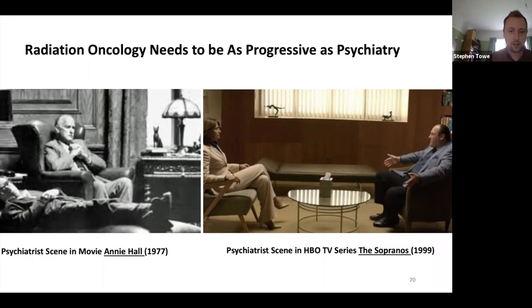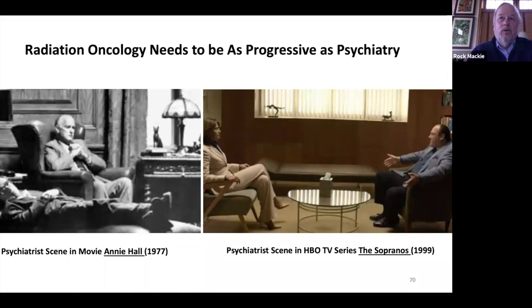We've got another question here from Thomas Borfelt. You've talked about some of his work as well there, Rock. But this one is, what are your thoughts about very fast imaging and treatment to reduce the need for stronger immobilization in the upright position? Yeah, no, I 100% agree that having MRI or real-time imaging of some sort would be great, so that you could either do effective gating or even utilize FLASH, which is the ultimate need for fast imaging.